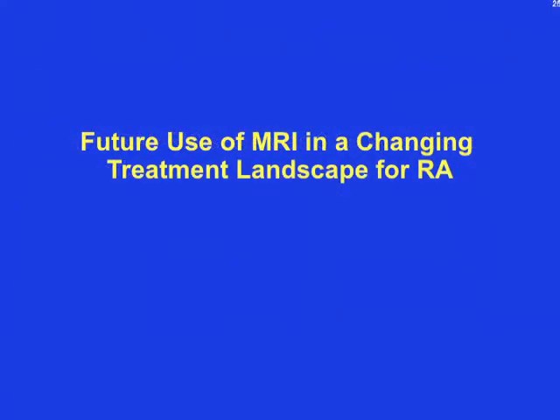So if we look at how we can use MRI in our offices on a daily basis, I think we can look at it in a number of different ways. Certainly early diagnosis, and there's one reference to a paper over there from Denmark, where in undifferentiated early inflammatory arthritis, the presence of erosions and osteitis absolutely predict that these patients are going to evolve into rheumatoid arthritis. So early diagnosis, allowing you to be possibly a little faster in your treatment choices.